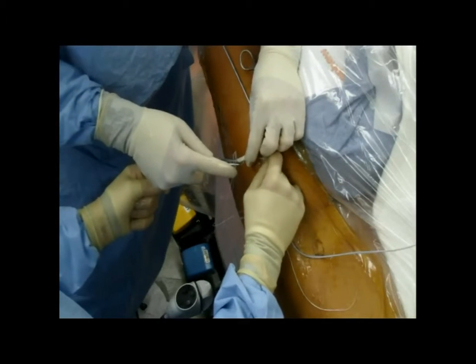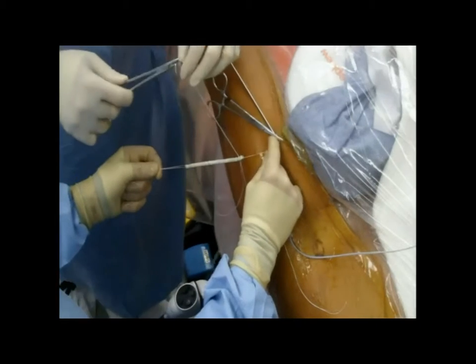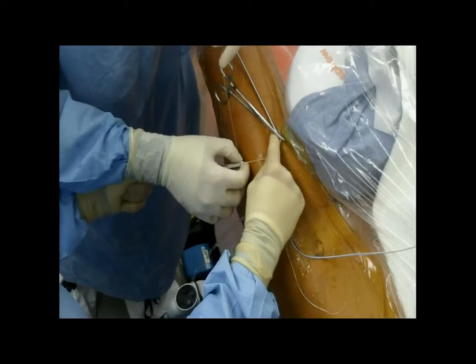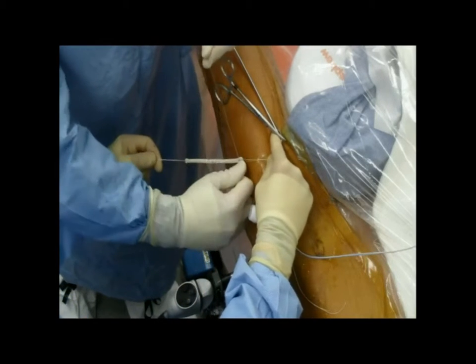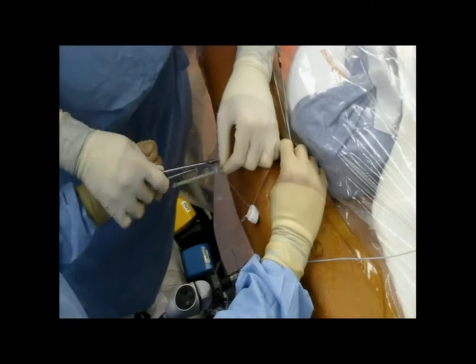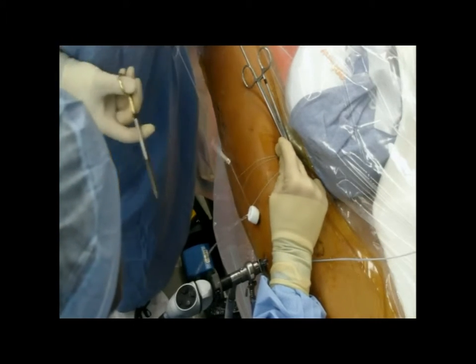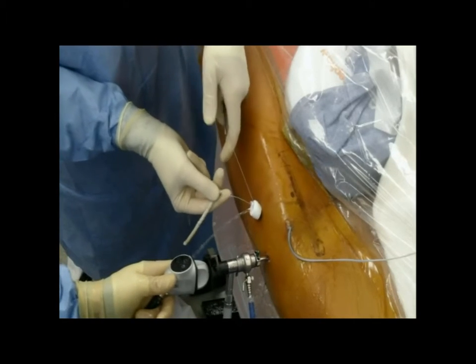I use the sutures that we have on either end of the graft to hold it while I place the suture through the graft for fixation to my most anterior inferior anchor to be pulled into the joint. Now that the knot is secured, I'm going to pass the suture to the opposite end of that knot. I'm then going to cut the holding sutures that were used in the graft preparation, then pull up on the post to shuttle the graft into the joint. Skipping steps during this aspect of the procedure or going fast and ending up with a non-uniform graft that's loose and poorly prepared will affect your final aesthetic product and will also make working with it inside of the joint increasingly more difficult.